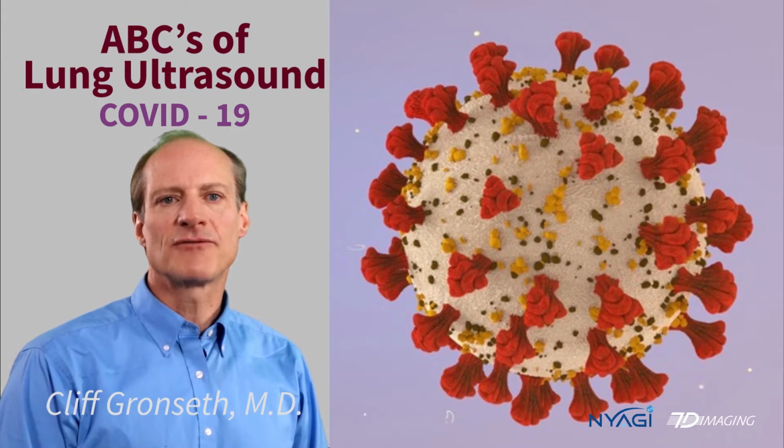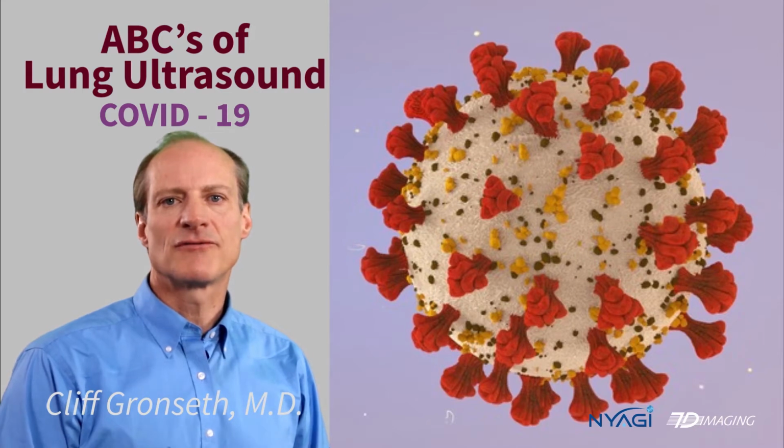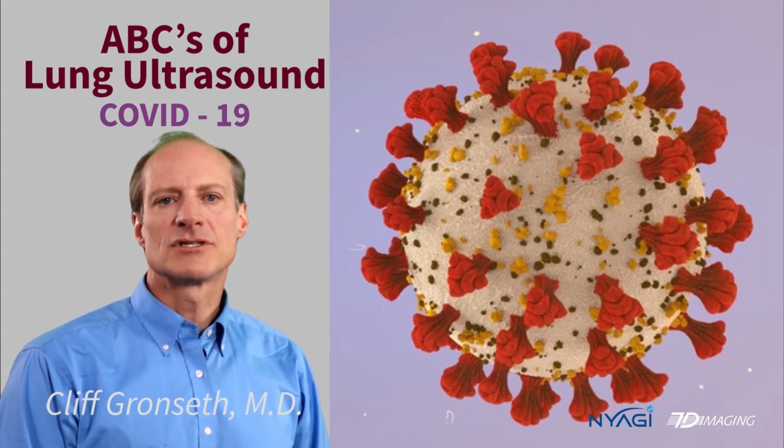If you have access to an ultrasound machine, lung ultrasound may be useful in helping with your clinical decision making. It's easy to learn if you know basic anatomy and ultrasound fundamentals. Realize that the ultrasound is an extension of your physical examination. Like the stethoscope that allows you to listen to the lungs, ultrasound allows you to look inside the body real time.